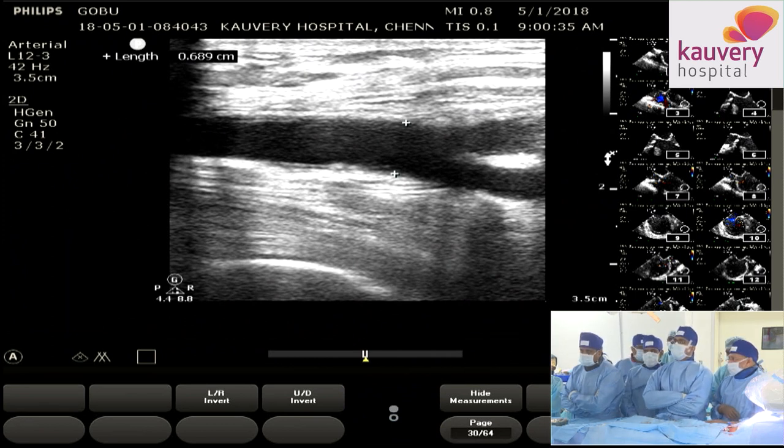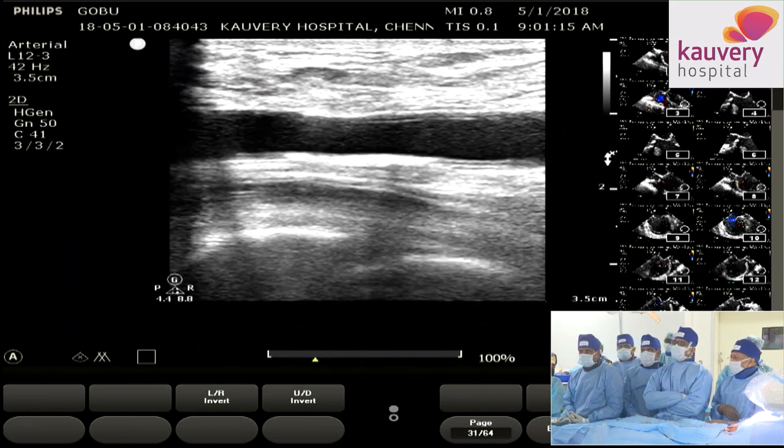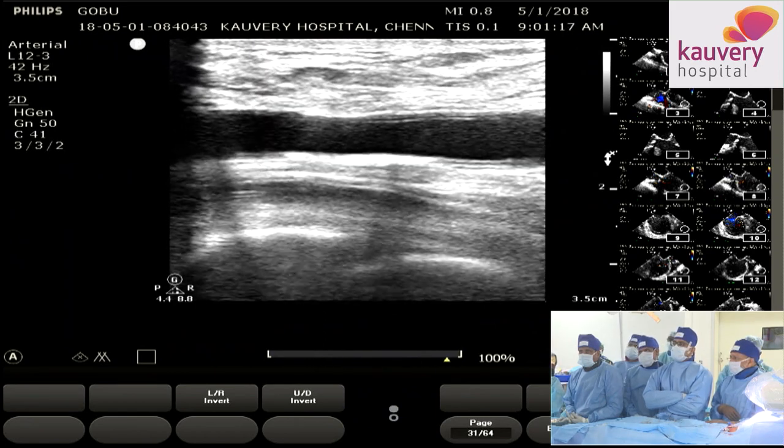So we are going to demonstrate the LIMA. Essentially, we have not measured the coronary height because we have not done a CT, and we're not going to bother measuring either because the LIMA is patent. Coming to the peripherals, it's 6.8. You can see here. The question was, if this patient did not have a bypass, how would you have measured the coronary height?